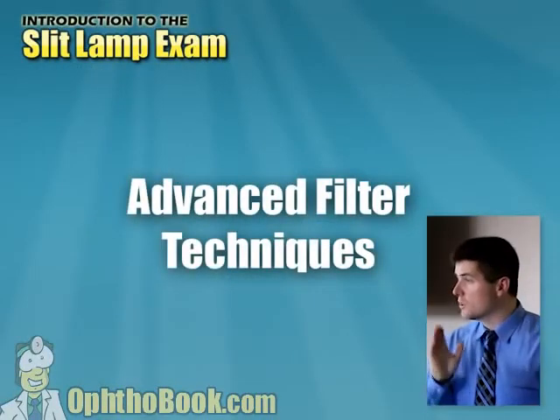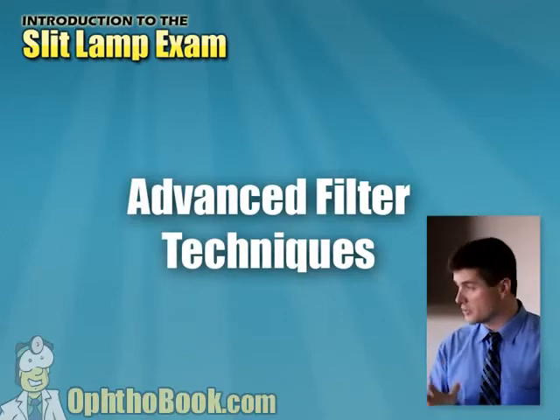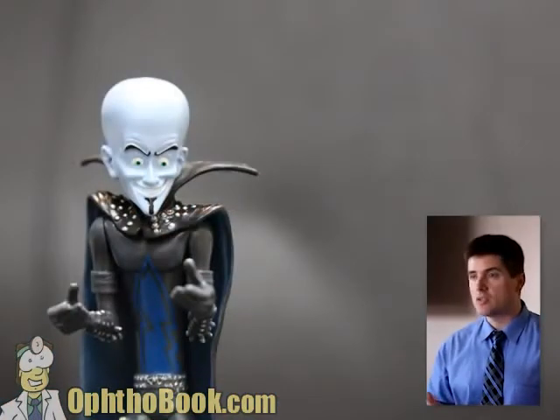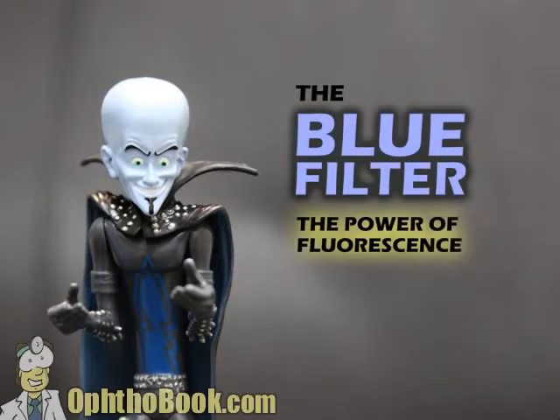All right, now we just went through a ton of information. The final section for this little lecture is going to be on filters. Now we all know this supervillain, yes? Well, this supervillain is going to introduce the blue filter. Now, the blue filter is useful not so much because it's blue, but because of its effect on fluorescein.